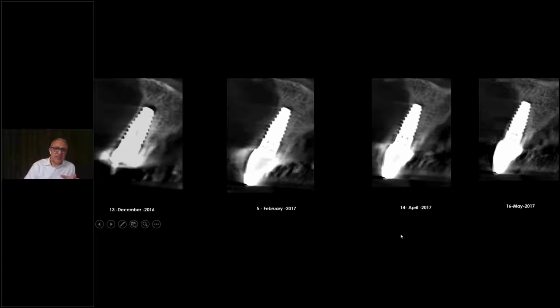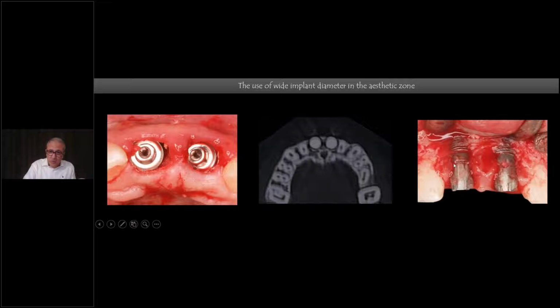So this is something that we really have to anticipate. The size of the implant, the diameter of the implant, has a lot to do with the size of the labial gap that we really need to take care of. That takes us to generalizing the term we use when saying wide diameter implant. So do we use these wide diameter implants anymore in the aesthetic zone? Of course not. Why? Because we lose the bone.